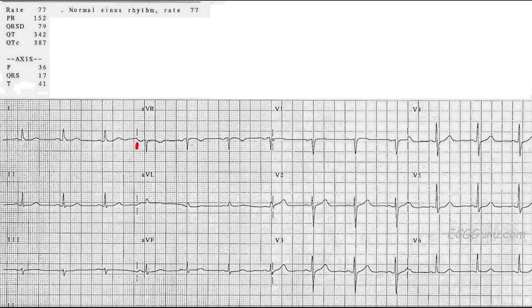The rate is 77 and there are P waves in front of every QRS, very easy to see here in lead one, but they're also present in every lead. If they're present in one lead, they're present in all of them. So P waves are present, it's a regular rhythm, and the rate is 77 — we have normal sinus rhythm.